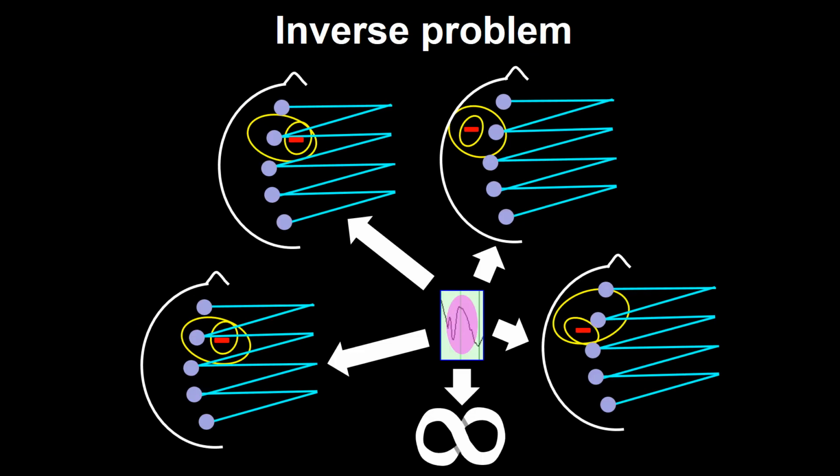Being as it may, the forward problem is not what the electroencephalographer faces every day. It is the inverse problem, what we have to wrestle with on a daily basis. Nevertheless, despite having no unique solution for the inverse problem, using certain assumptions, the voltage source or generator can be correctly approximated in a significant number of times.